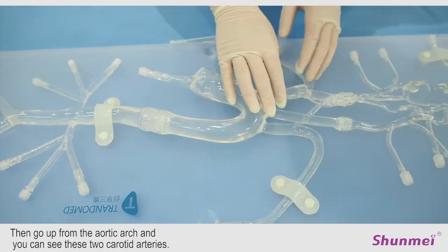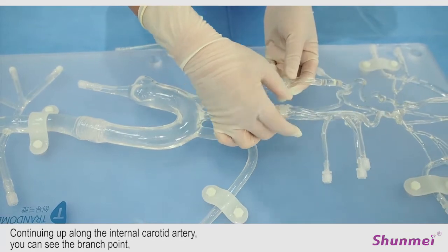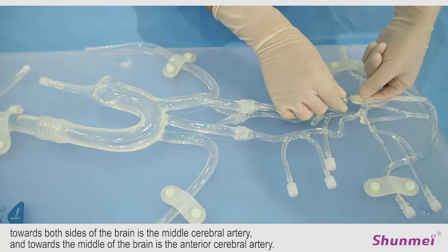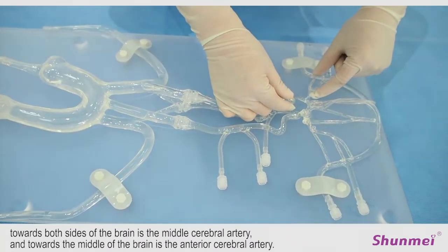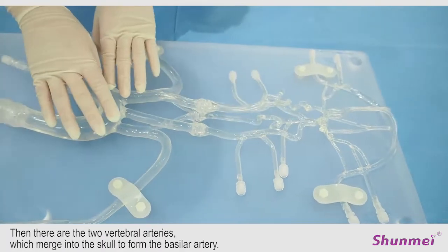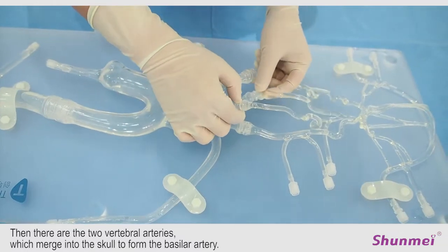Then, go up from the aortic arch, and you can see these two carotid arteries. Continuing up along the internal carotid artery, you can see the branch point. Towards both sides of the brain is the middle cerebral artery, and towards the middle of the brain is the anterior cerebral artery. Then, there are two vertebral arteries which merge into the skull to form the basilar artery.